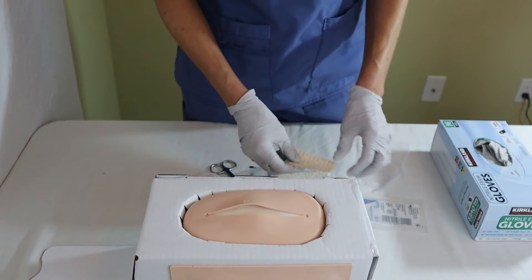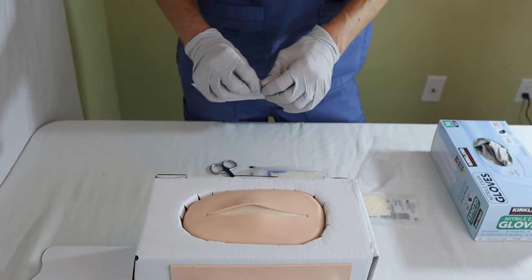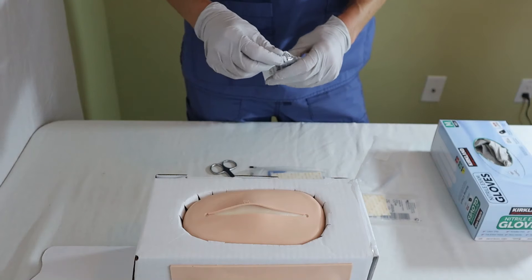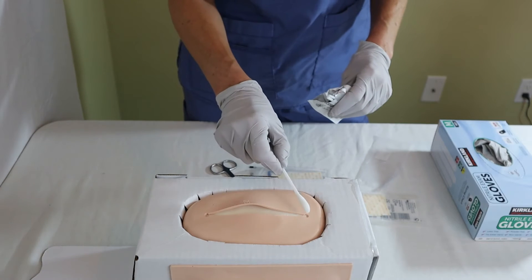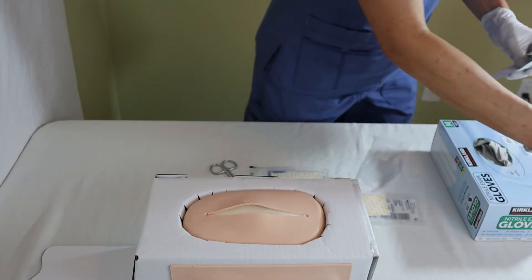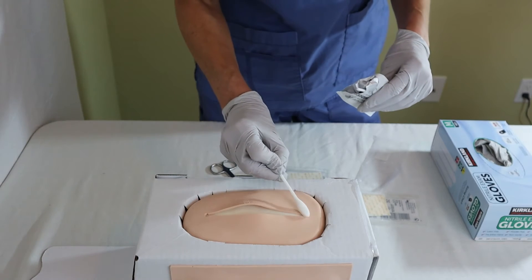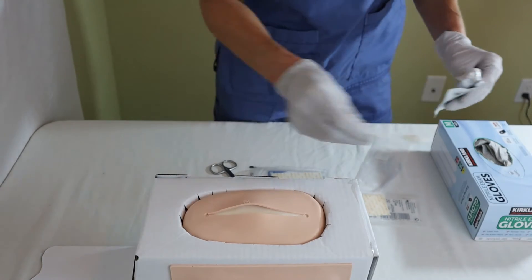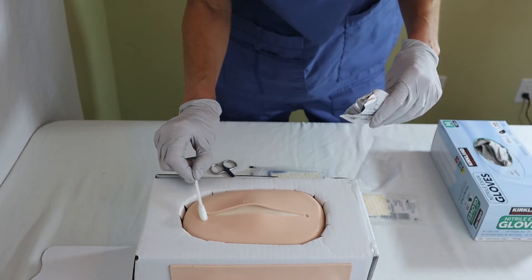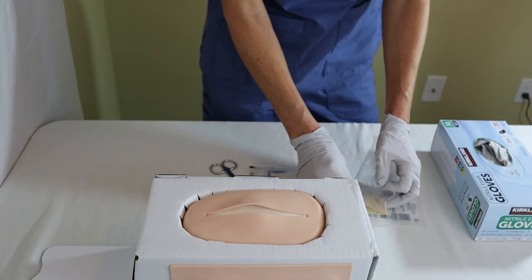Now that I've cut my strips and put them back in their wrapper, I will take the cleaning solution and clean the wound as we usually do — from one side to the other on one edge, dispose of that, then clean the other edge, and then clean down the middle. Now I'm ready to apply my SteriStrips.